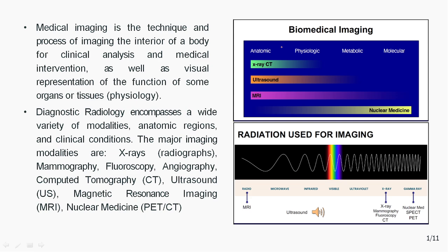Now we have different diagnostic modalities, with different anatomical regions and clinical conditions. Depending upon that, we can use different technologies. The first one is X-ray technology, which we normally know as radiography or radiographs.